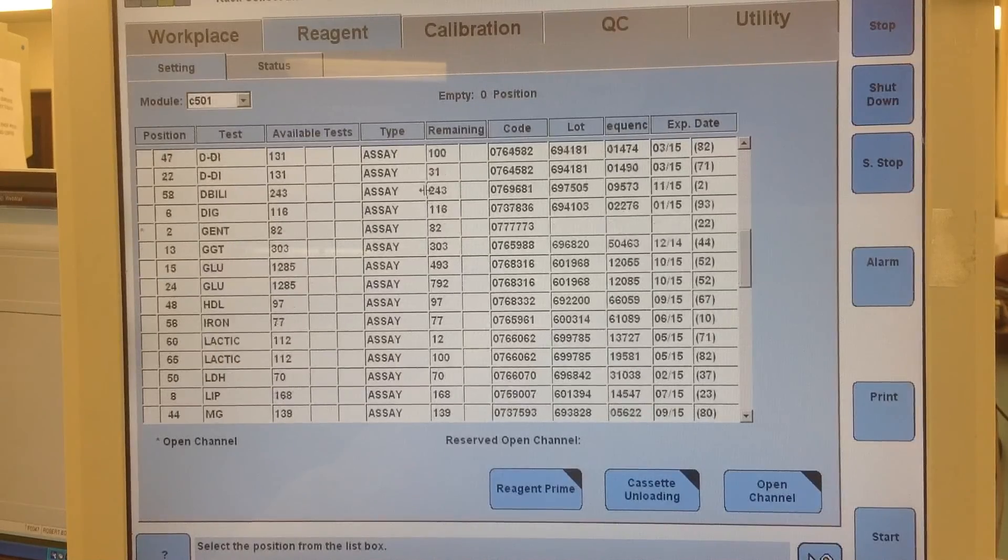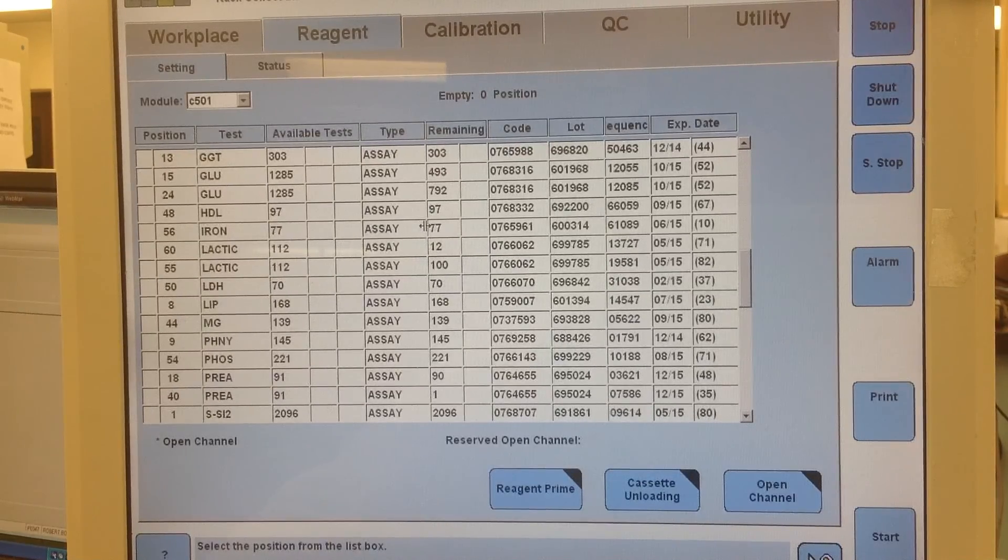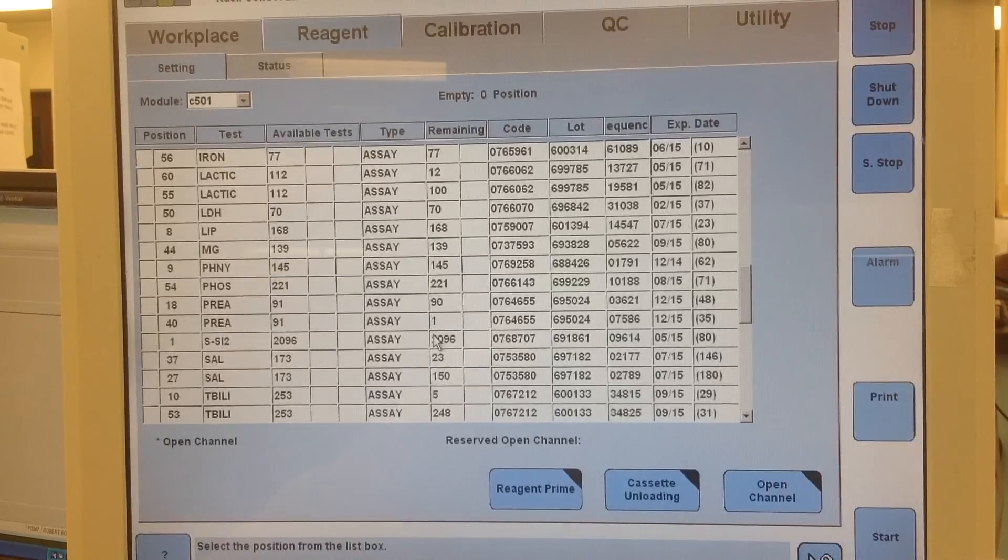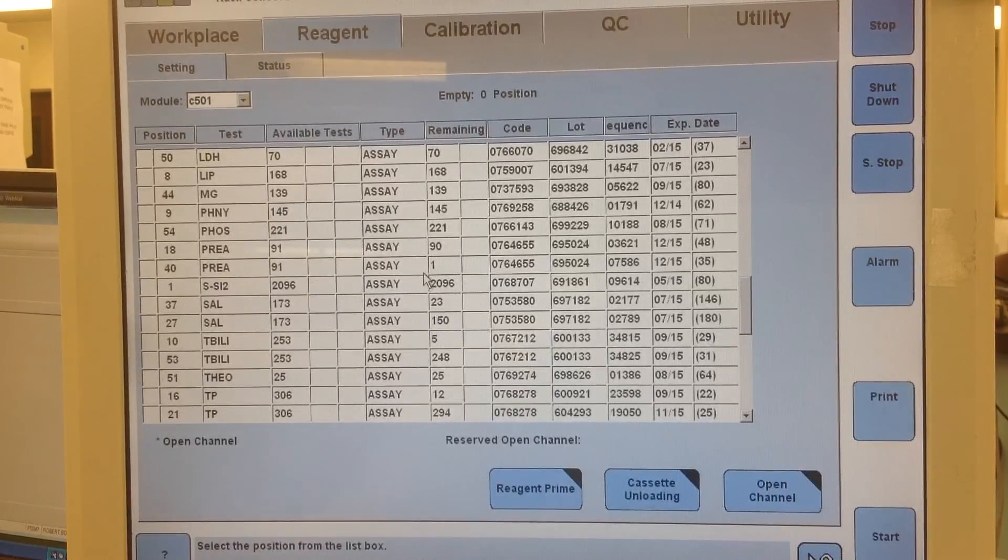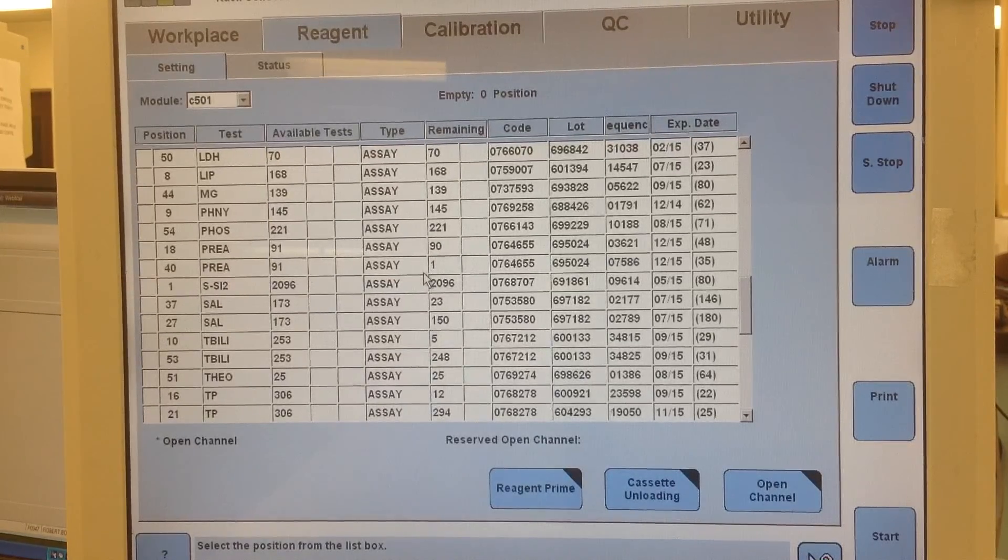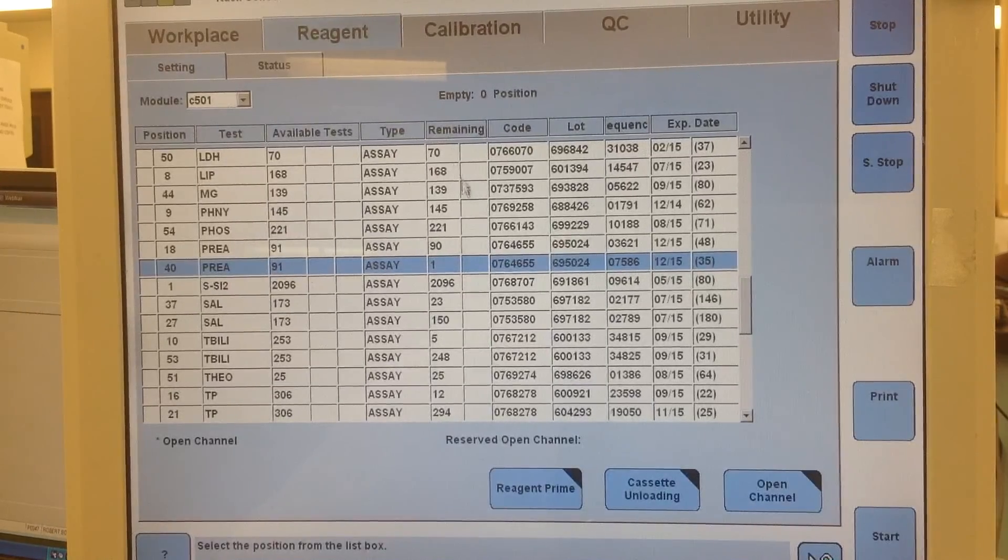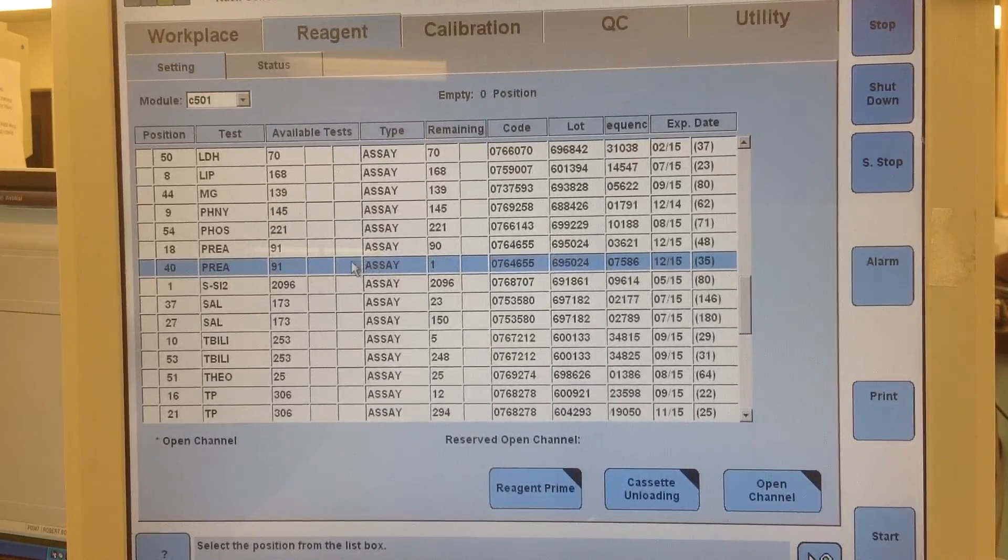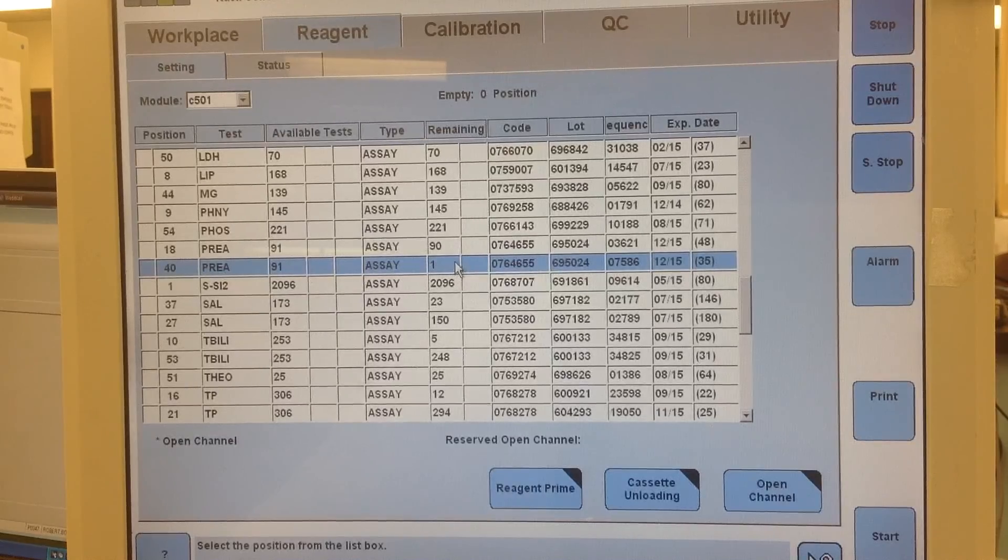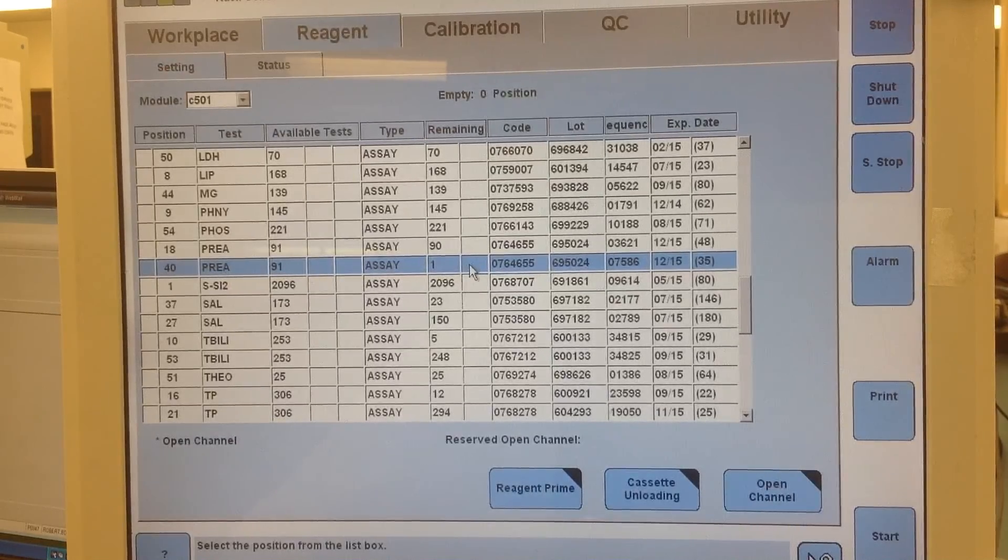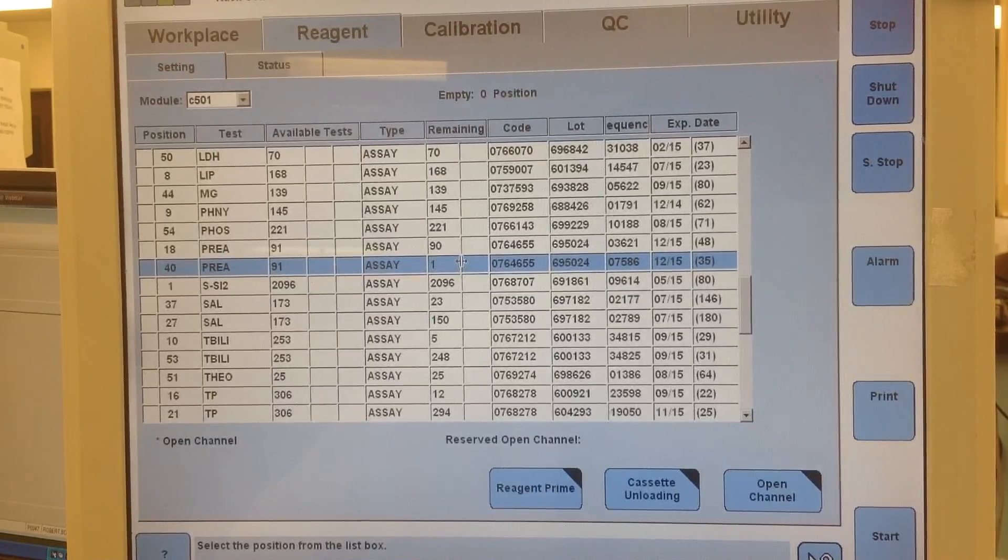Basically what I'm looking for is if there's not enough to either go through a calibration or QC before it runs out. So for instance, pre-albumin here only has one reagent remaining. You can see remaining one, so that means I might as well dump that when I bring it into standby because there's not going to be enough to QC, it's just going to run out.